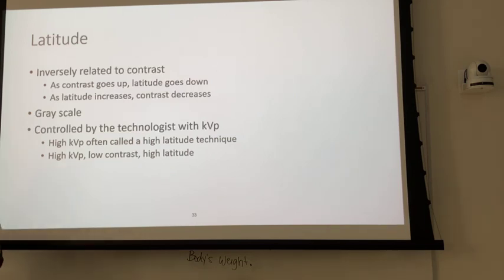You can make an exposure, especially with the computer algorithm being the primary control of your contrast. Theoretically, you could make an exposure of a hand with 150 KVP. It's just not going to be pretty. Okay, so you have more latitude with KVP.